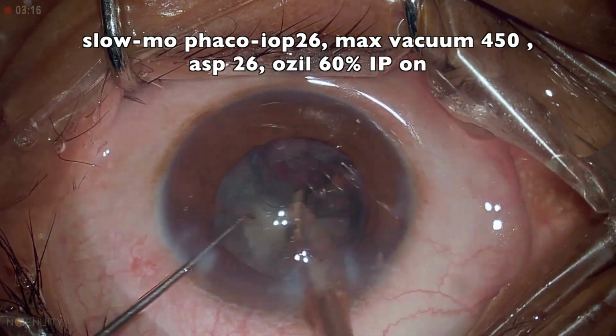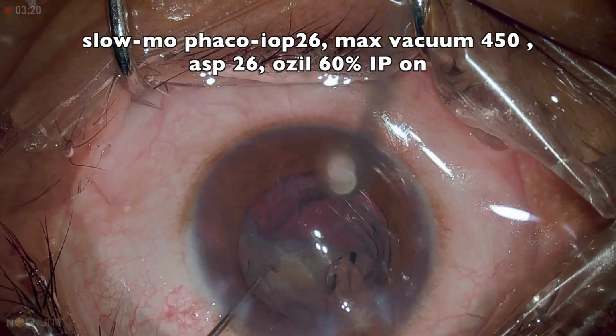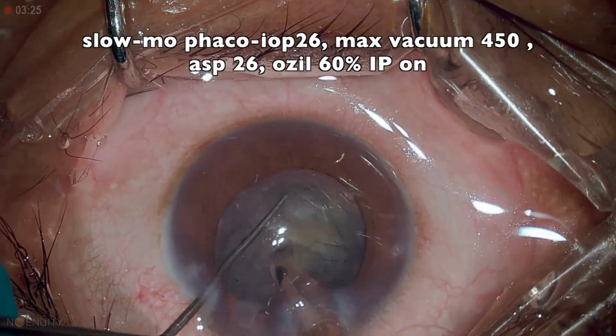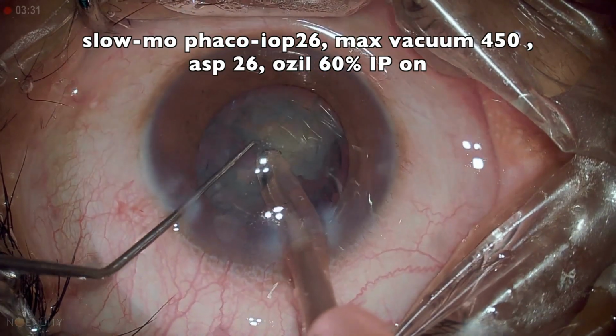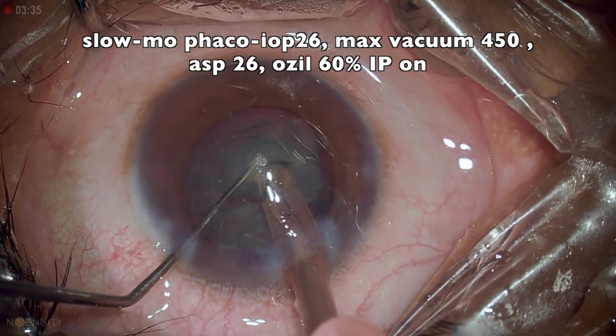With the slow-mo phaco, we did not find any problem during the phacoemulsification, and in fact, it went on pretty smoothly. It seemed as if there is no rent at all.